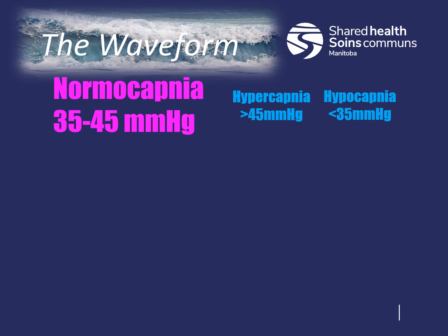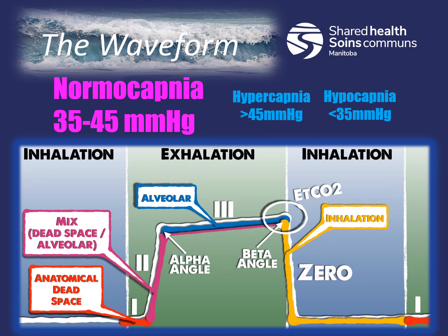So what is the waveform itself telling us? Not only is there value in the numbers provided, but the characteristics of the waveform are highly informative as well. By assessing the waveform, a comparison can be made to the patient's physiology and assist with differential diagnosis and treatment decisions. There are many physiologic waveforms that paramedics will encounter while monitoring a patient.